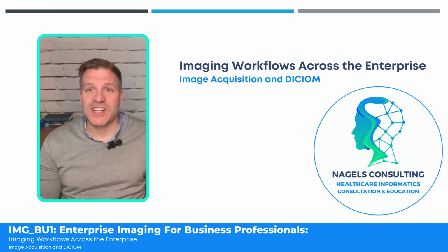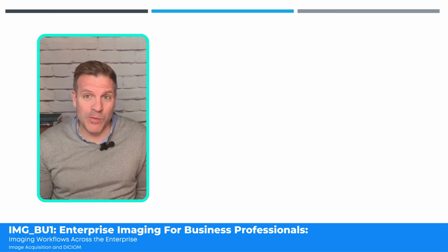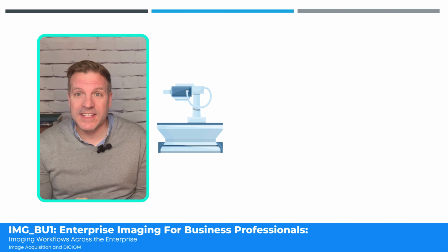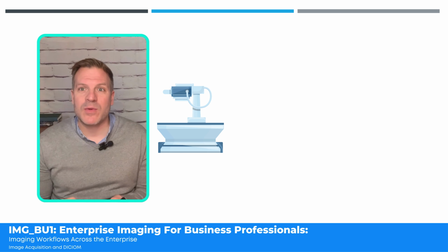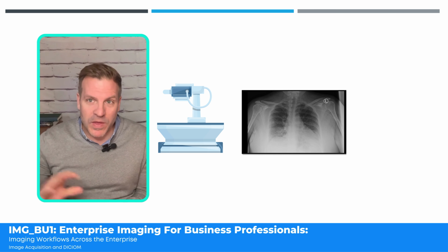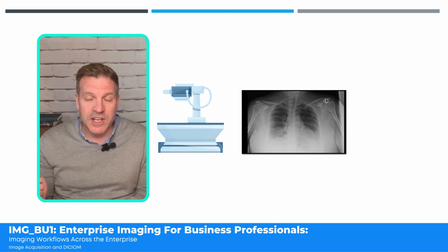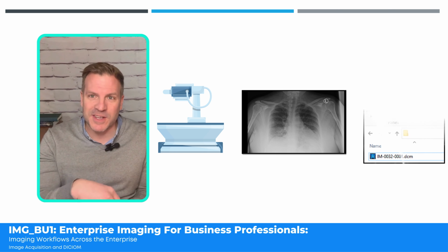Welcome back, and in this section we're going to look at DICOM and its relationship to image acquisition. So far we understand that there are modalities, and these are the image acquisition devices. So the modality is generating the image. If we think back to earlier on in our discussion, we understand that the image is sometimes referred to as a payload that goes inside of the DICOM container.